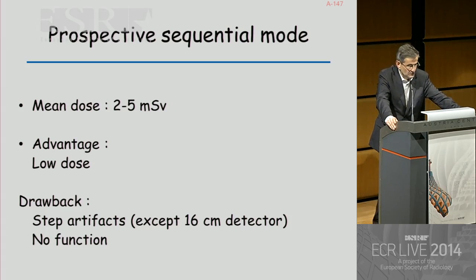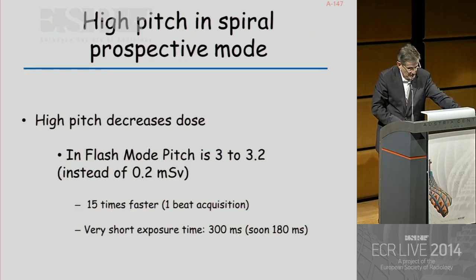However, the mean dose is low, between 2 and 5 millisieverts, and you don't have function, which can be a limitation in some cases.